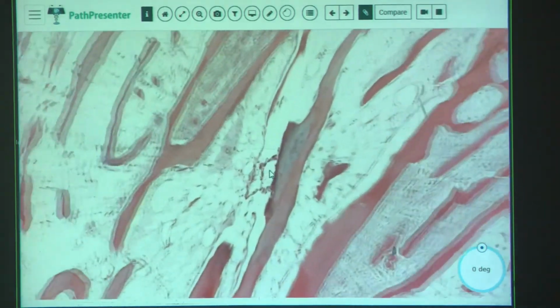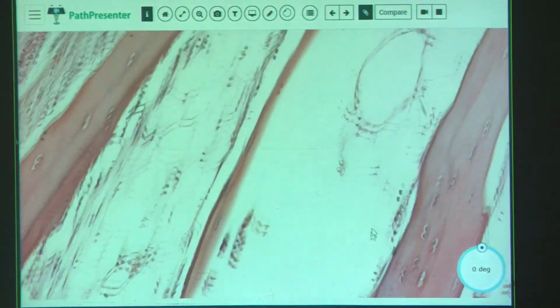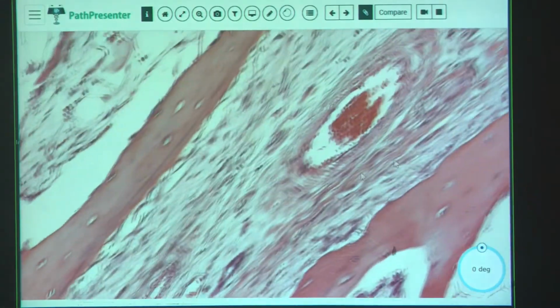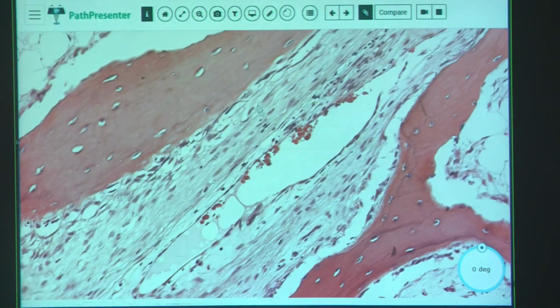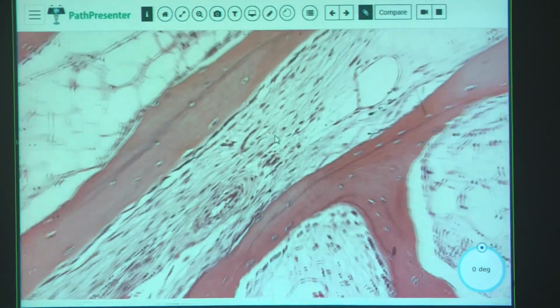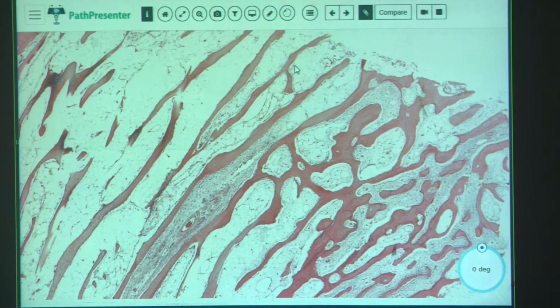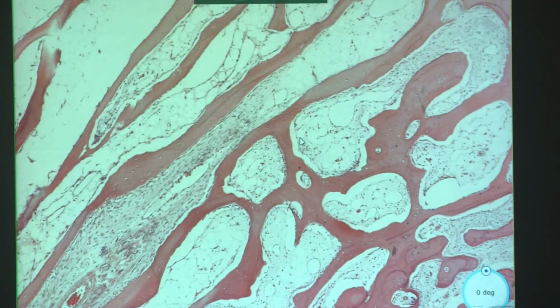Osteoblastic rimming. I apologize because I think I said osteoclast giant cells, which I don't think are associated with this, but that's why we have notes and why the slides are coming up. But it does look like there's some areas where you have osteoblastic rimming. So that's something that you can see with this, but again, you don't have to see it. Oh, we got knocked out. I'm sorry, I don't know when that happened. Probably a while ago.